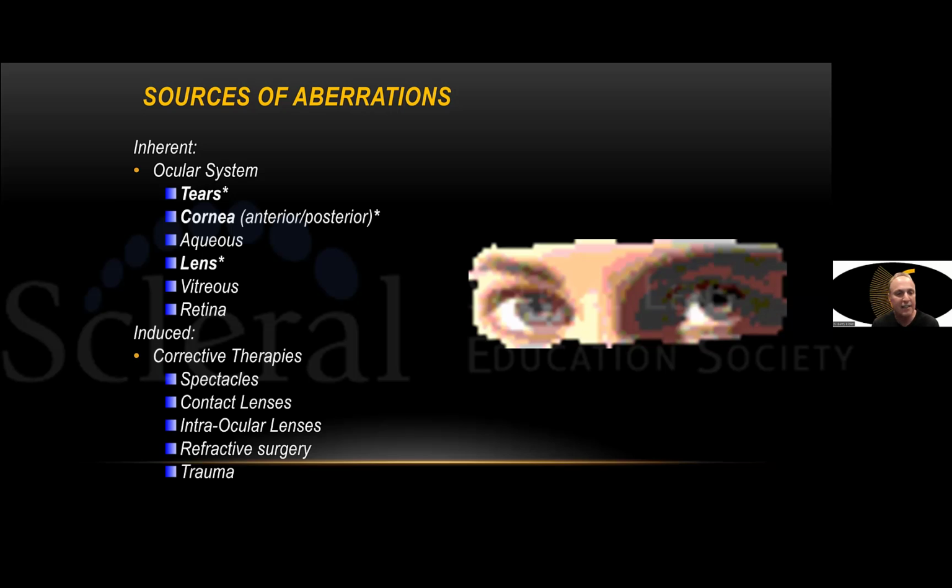Intraocular lenses, we see this all the time. Because we run aberrometry on, in essence, every patient that we do an exam on, those who have had IOLs, even with very good acuity, we often see residual high order aberrations. If the lens is decentered a little bit, some of the multifocal lenses, especially when those are decentered, and so forth. Of course, refractive surgery very often can cause influences in high order aberrations.